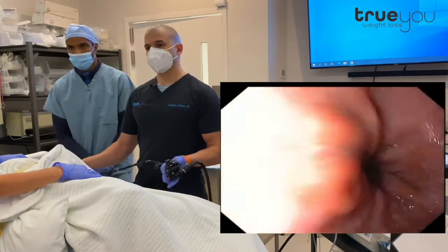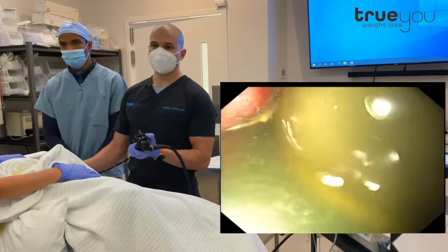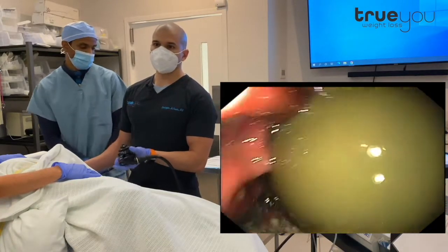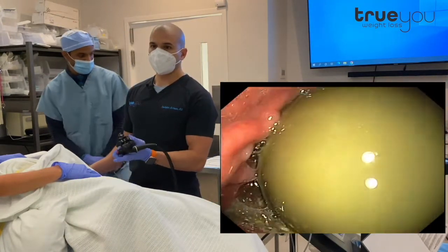Here we're going down the esophagus, we're in the stomach, and there's her balloon. There's a little bit of water, which is common. The balloon, over six months, becomes a bit discolored — kind of greenish. It starts out clear. It's filled with sterile saline, and we are going to take it out.